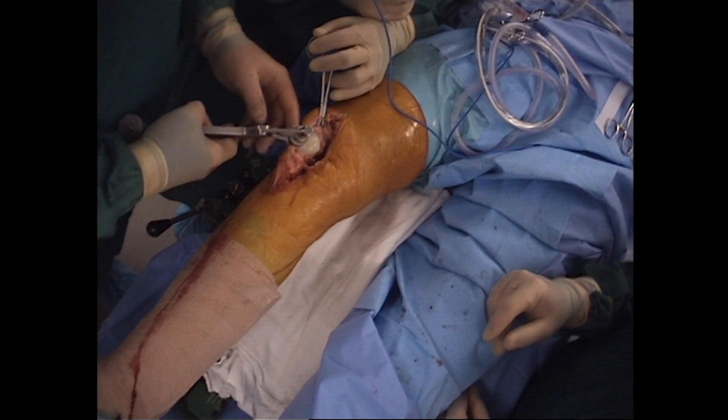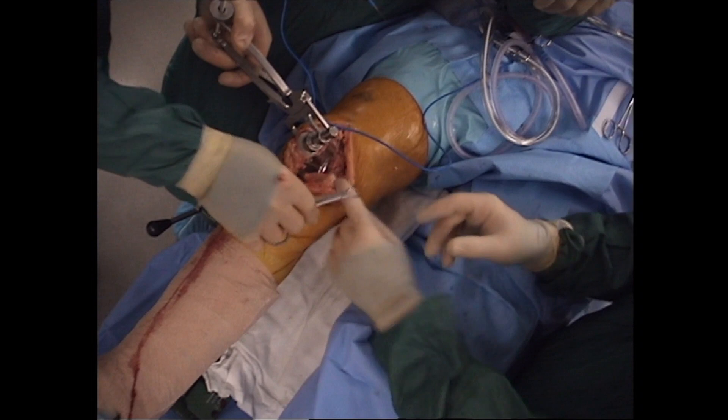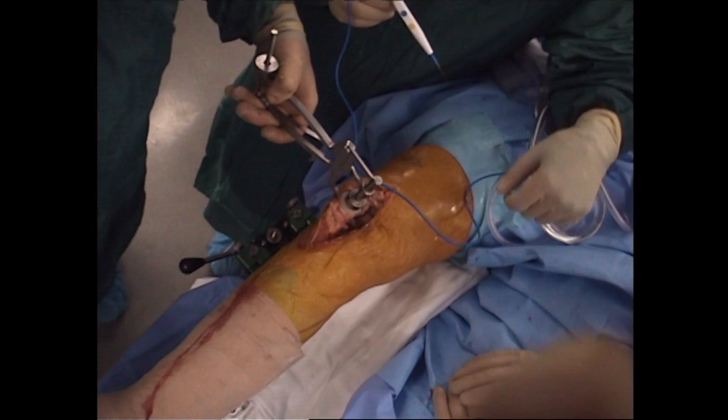The patellar component is cemented into place in standard fashion. Here we are using a vitamin E poly, which is 7 millimeters in thickness. At this point, the tourniquet is let down and a C-arm is brought in to take a true AP and true lateral image of the prosthesis. This verifies the cuts and the coverage of the press fit implant. Once again, this is Dr. Michael Moorwood from Hoffman Arthritis Institute and today we were demonstrating the TJO Classic Cementless Knee System.